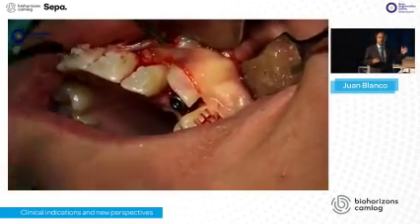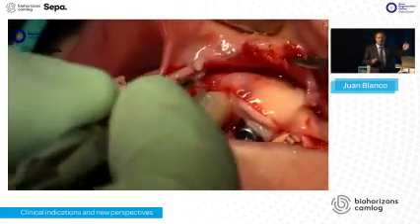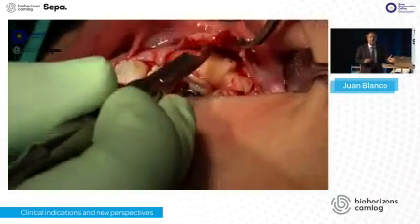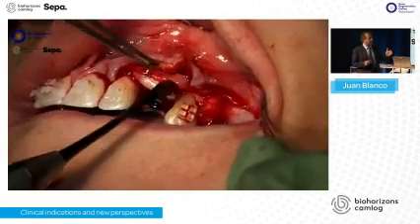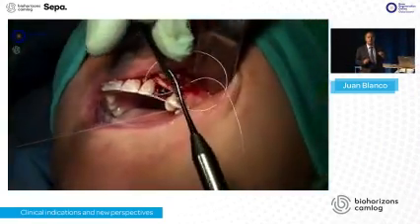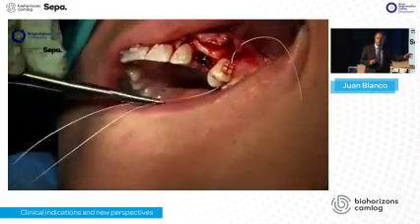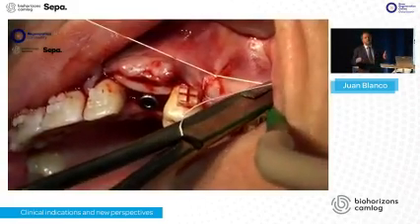And according to the papers by Anton Skulean, probably this is the best choice to do the right things. One, to obtain guided bone regeneration. The second is to increase the thickness of the flap, because we use this membrane, and also we are using biological and active proteins that are going to be trapped on the membrane, and they are going to suffer a slow release in time.